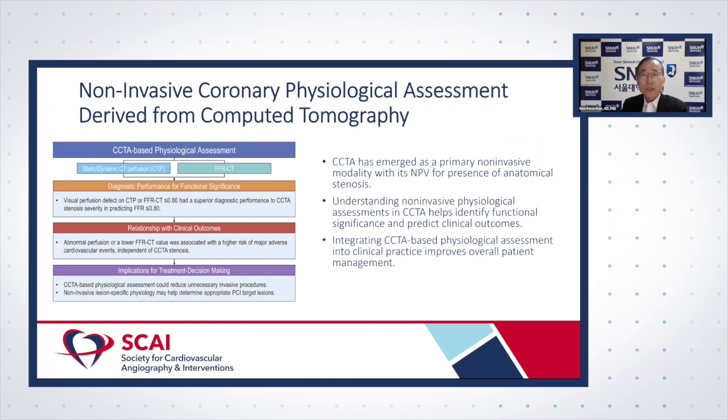So in this review paper, we discuss some details about the CT perfusion images, but more focused on CT-FFR. We know that the functional assessment or CT-FFR can be derived from the CT images, which provides a very nice performance in defining the lesion-specific ischemia, and it's already commercially used in the world. And there have been so many studies which initially show its diagnostic performance in comparison with the invasive measure FFR. And we also now have several outcome data, including 3-year outcome, 5-year outcome, and 10-year outcome data.